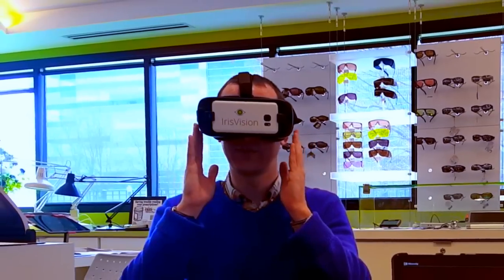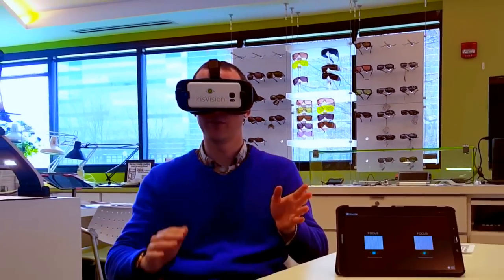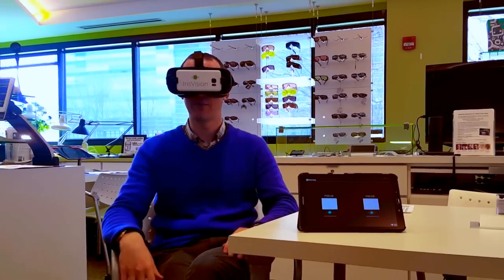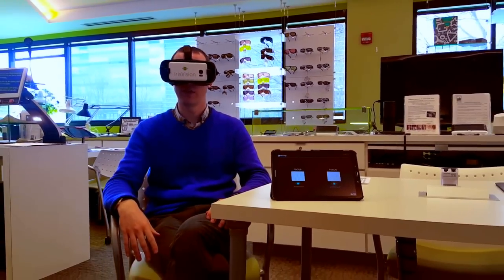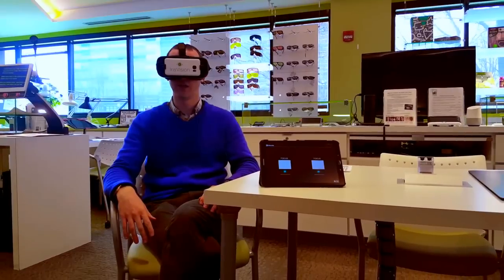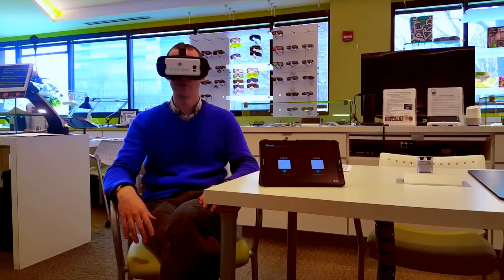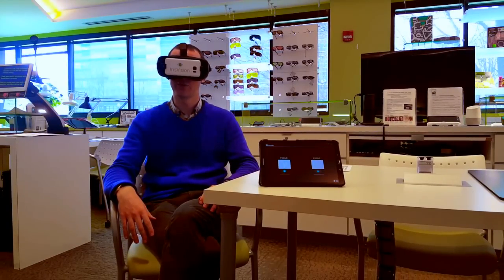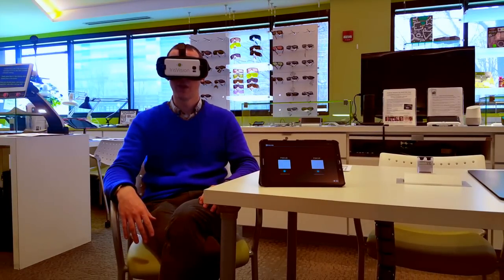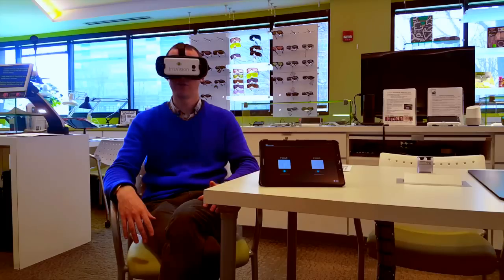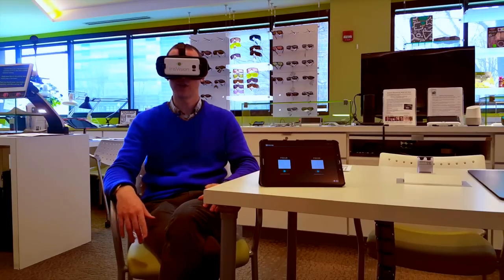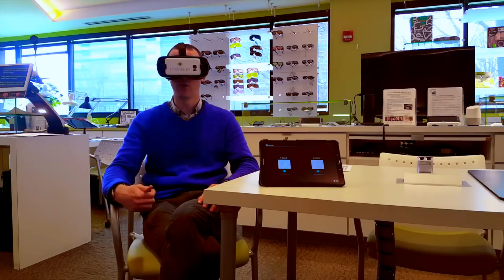So I put the device on, and to my left there's a tablet. Hopefully you will be able to see what I'm seeing inside here on the screen of the tablet. Now you will see two images on the tablet, one for each eye, however I only see one complete image.